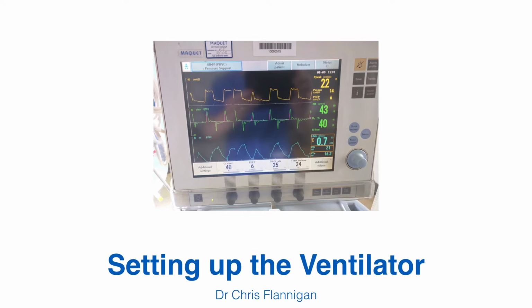So what's the next thing you need to tell the ventilator? How many times a minute to blow into the patient, and that's your respiratory rate. So you pick a number for respiratory rate on the ventilator, and that's generally determined by the patient's age. So as the patient gets older, the rate that you set will go down. And I'll cover what the normal ranges are a little bit later in this talk.